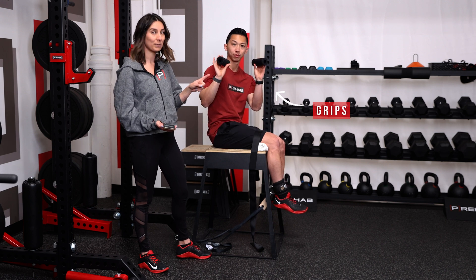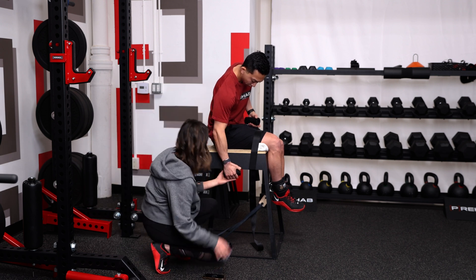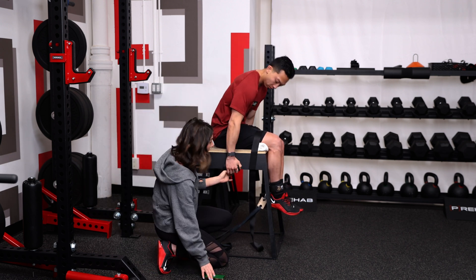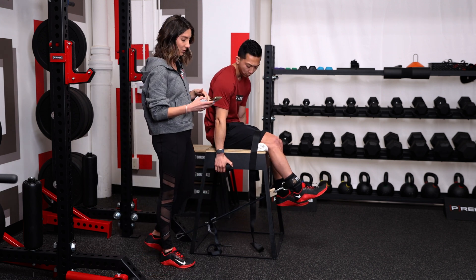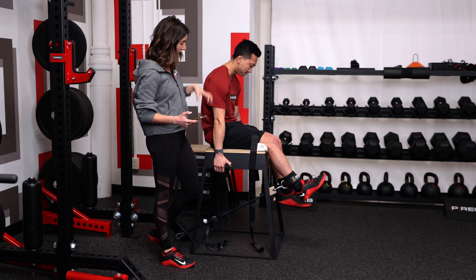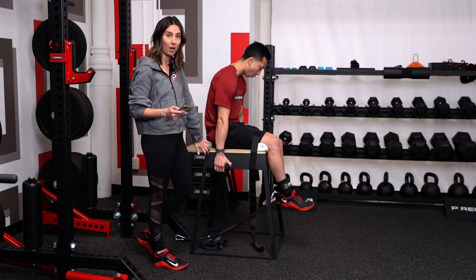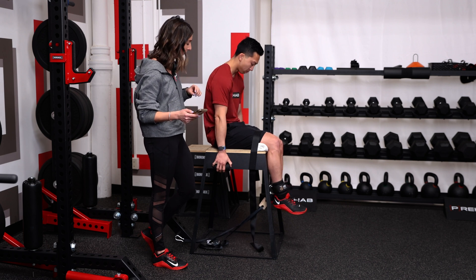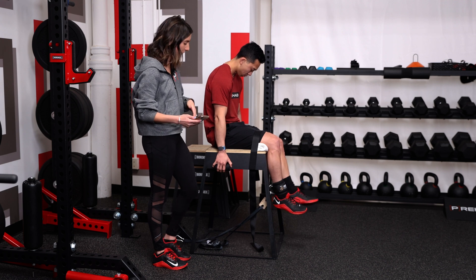We like to give our patients grips to hold onto, because we've been told subjectively this is not very comfortable. If our goal is max effort, we want to make sure they're as comfortable as possible. You'll notice he's going to end up slouching forward a bit because of our setup — that's totally okay, because we're using the same box every single time, which is what makes our setup reliable. If your setup allows the person to be more upright, that's also fine, just make a note of it.